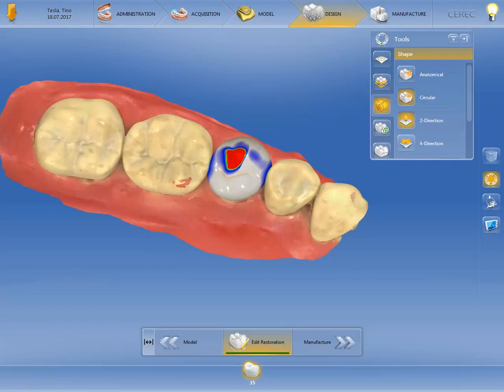As we had chosen the design mode biogeneric individual in the administration phase, the CEREC software analyzes the patient's own remaining teeth and calculates a nature-identical morphology, which we have already modified with the shaping tool to some extent.